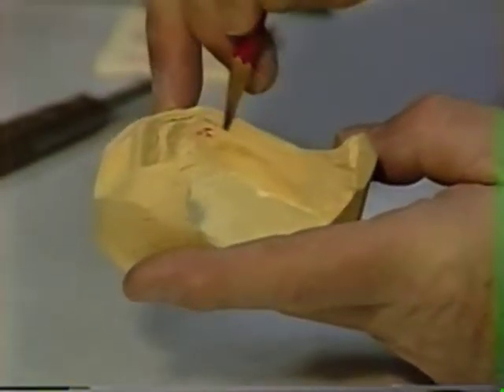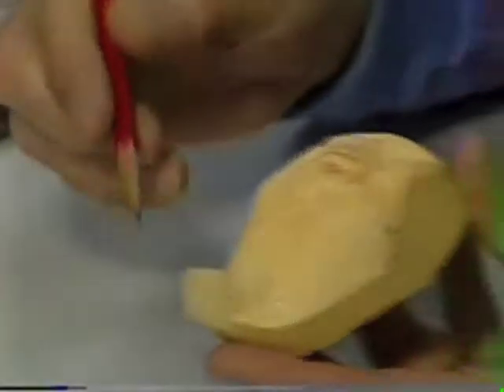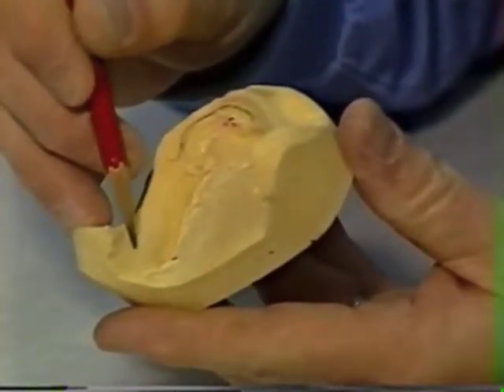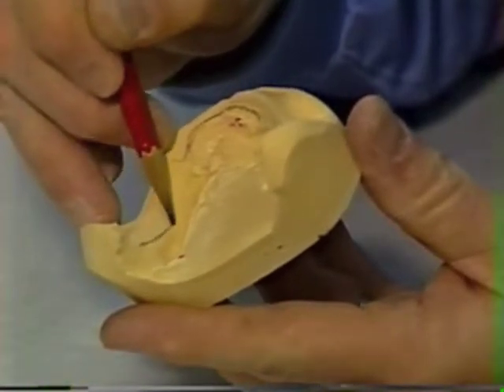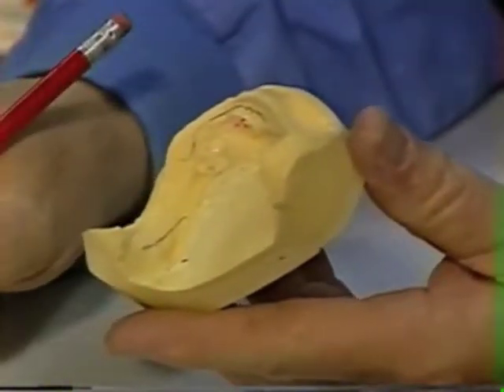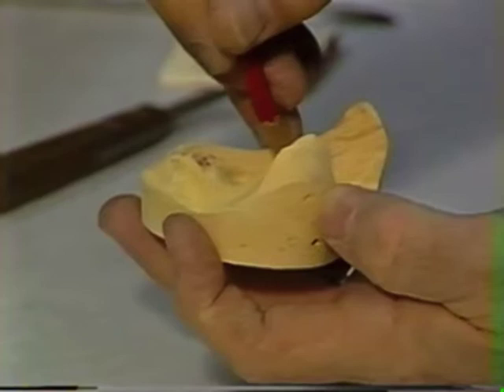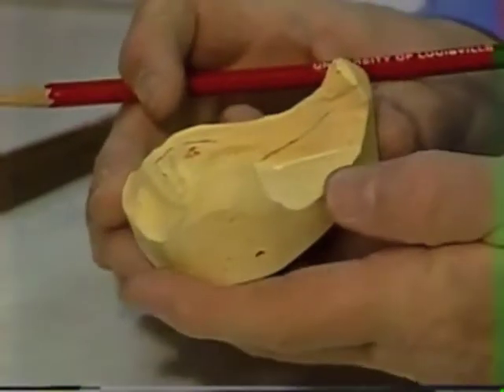through that sublingual crescent area. We want to remember the mylohyoid ridge, and on the mylohyoid ridge on this particular patient, it starts right about there and it comes forward about like so. On the other side, the mylohyoid ridge is starting right here and it comes forward. That's the mylohyoid ridge.